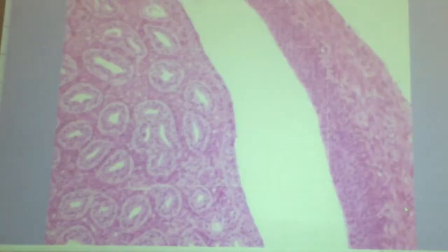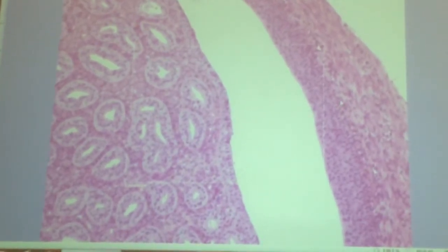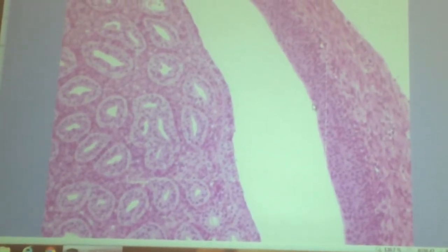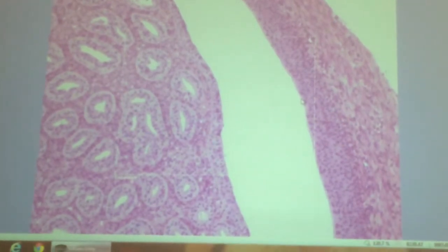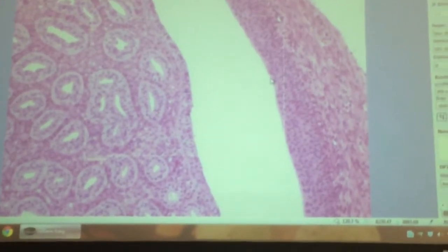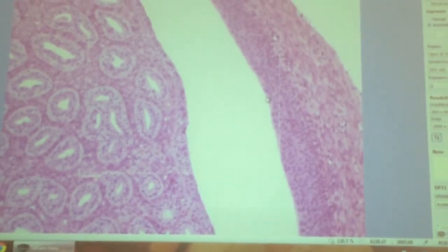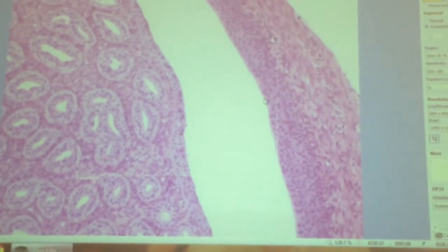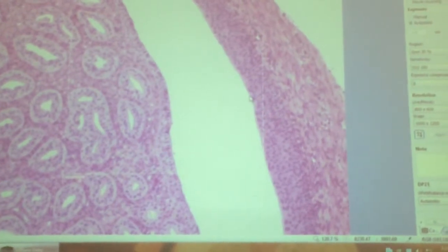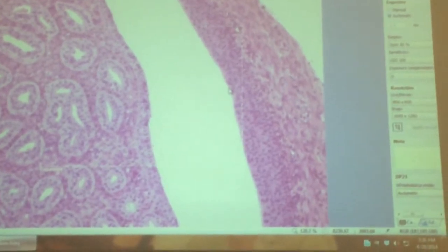Okay, you've got your papillary ducts there. And here you can see that this is again the minor calyx, and this is great transitional epithelium from here on up. Transitional epithelium is just layers of cells, where the cells at the apical surface I think of as very fluffy. To me, they look like big giant pillows, very soft and fluffy. The reason they're so full of cytoplasm up in the apical layers is because they can be compressed, essentially squished. And in this case, they're compressed by the urine volume that fills this area. So within a lot of this urinary tract, you're going to see this transitional epithelium for the purpose of allowing that compression and ability to fill with fluid.